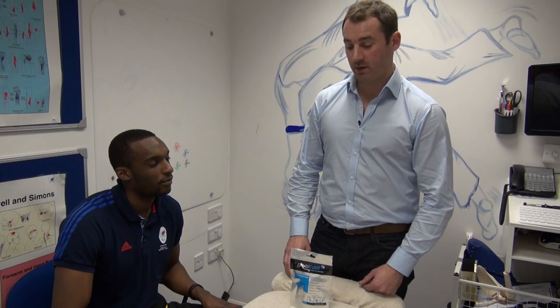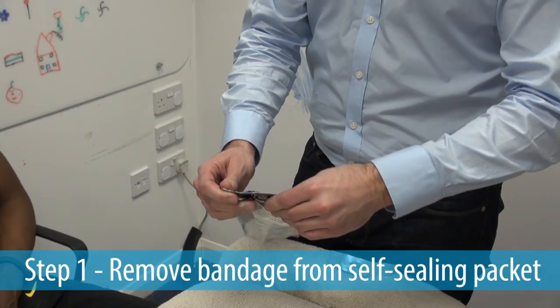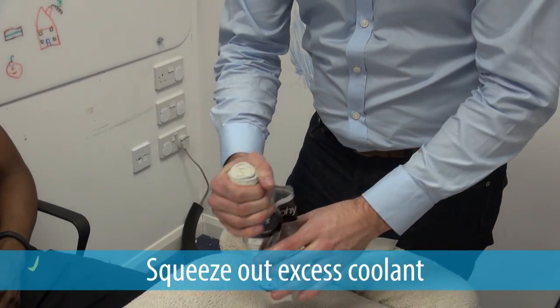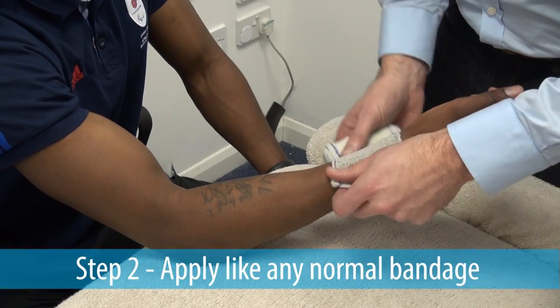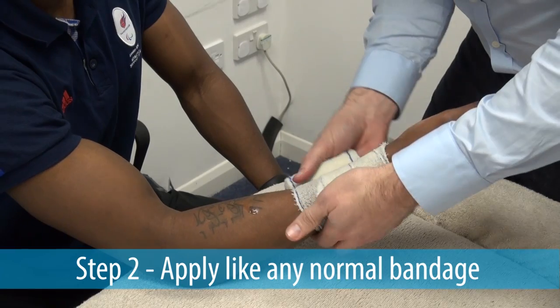Physicool is applied in three easy steps. Step one is to remove the bandage from its self-sealing packaging, and while you're doing it, squeeze off any excess coolant that can be used later. Step two is to apply the bandage as you would any normal bandage. As it goes on, overlap slightly.